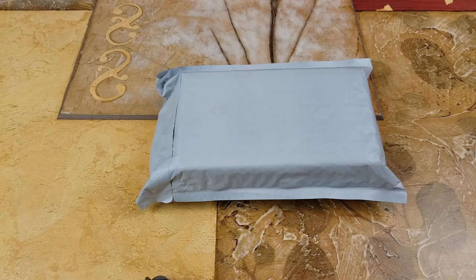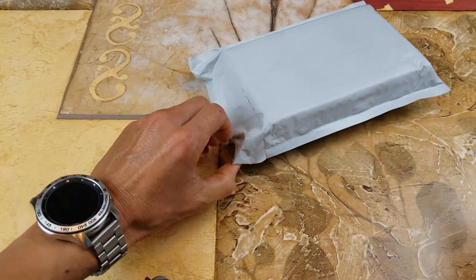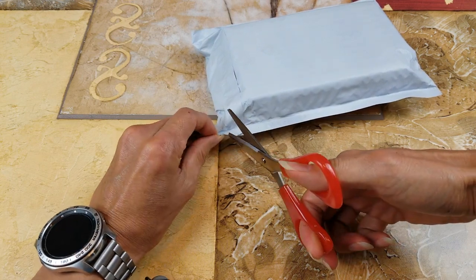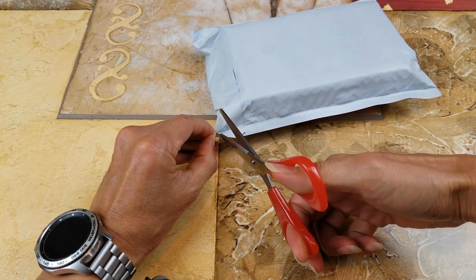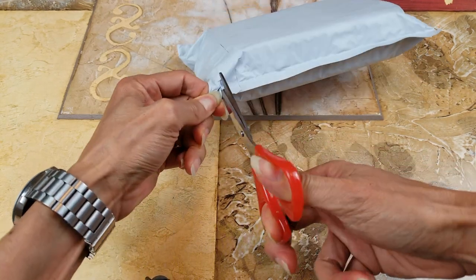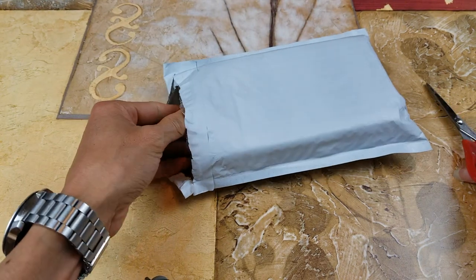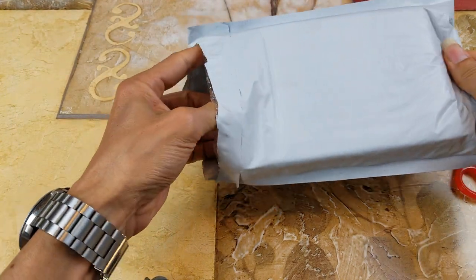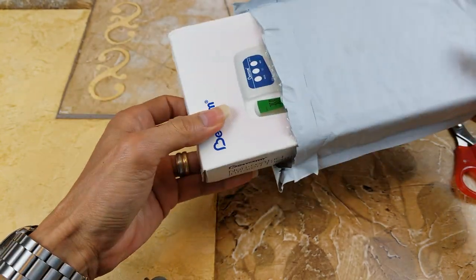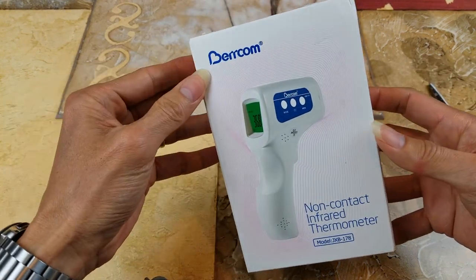Let's go ahead and unbox this and I'll show you guys. It might be a small size. So you got a little damage or banged up on the box. There you go.